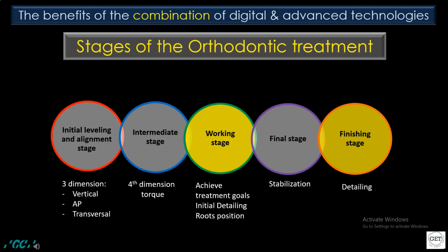The self-ligating bracket systems, due to the fact that they do not use elastic modules, present a very low friction system. As a low friction system, they can be considered as determinant systems, where forces can be calculated and, as a result, additional forces can be applied with good feasibility.